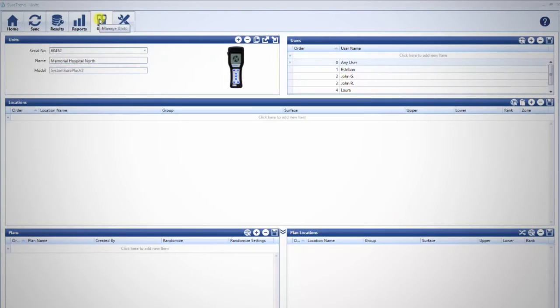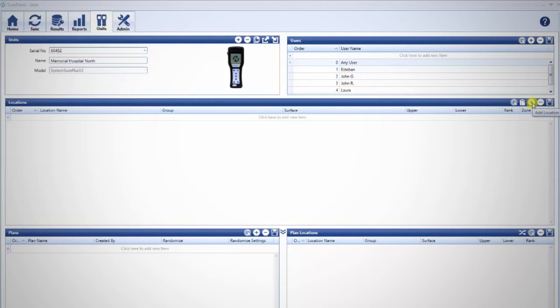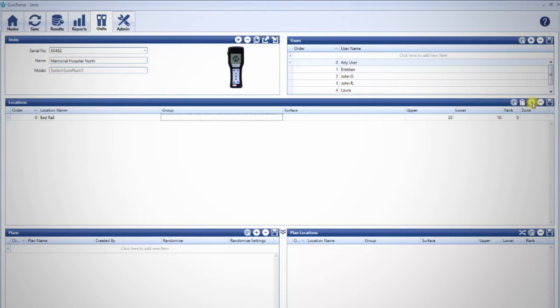Open SureTrend. Navigate to the Units tab. To add test points, click the plus sign on the top right of the Locations pane.